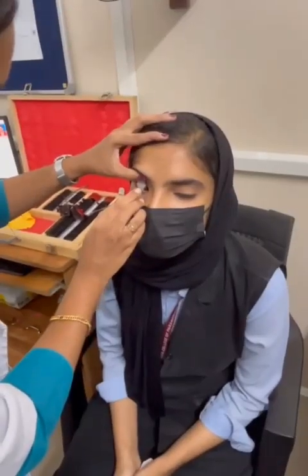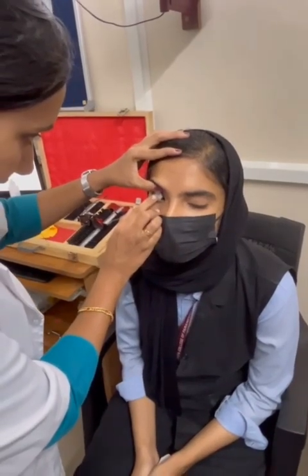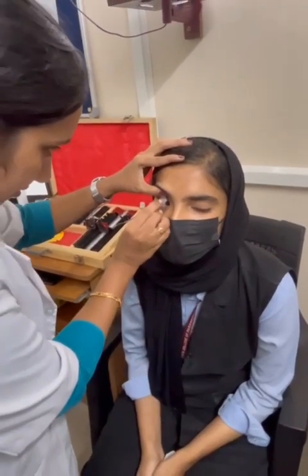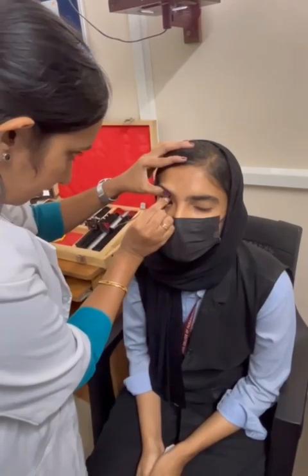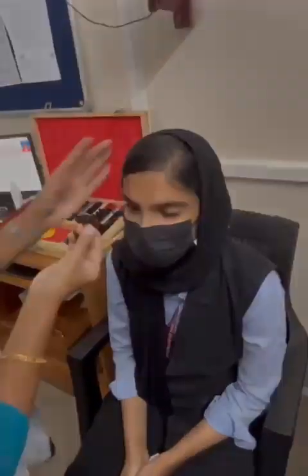Then the removal technique. Hold the upper lid with lashes and ask the patient to look upwards or sideways. Gently pinch off the lens with your index finger and thumb.